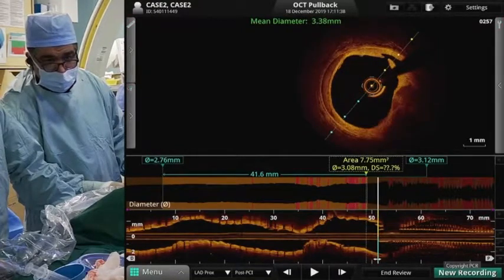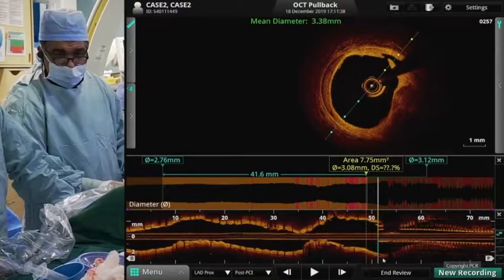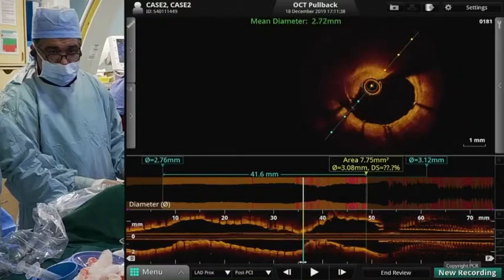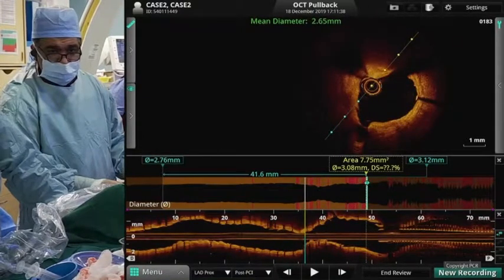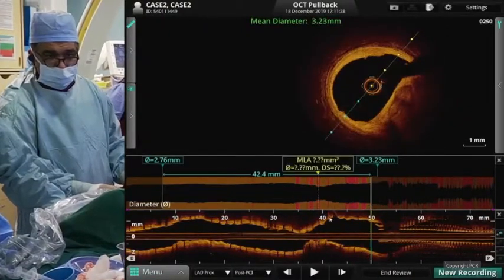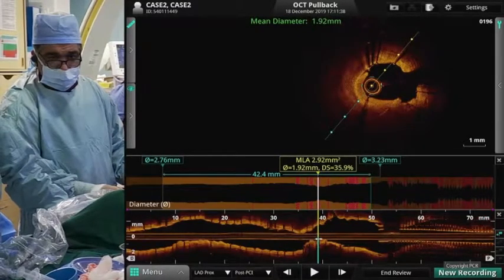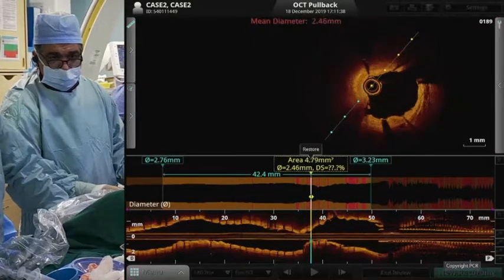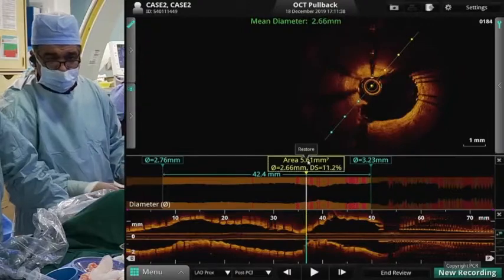I'm more concerned about the area about 35, if you see it on the longitudinal. Exactly, yeah. Can you go back to the 35, right there. That is the tightest segment of the stent. Yes. What's the MLA there? And in this area, the image you see is due to the tortuosity of the vessel. Where's the angle? Go back at that. No, the catheter here. Yeah. And now rotate a little bit.